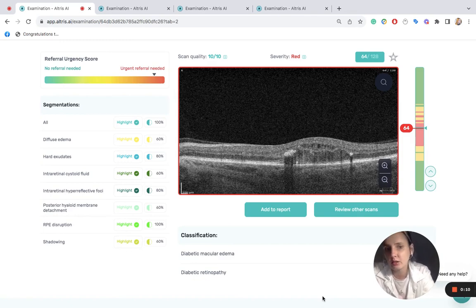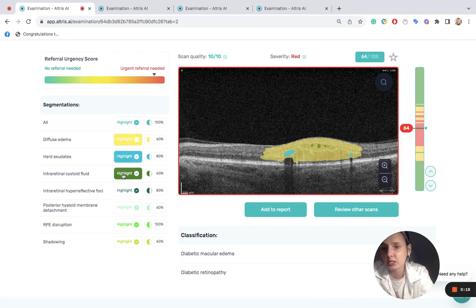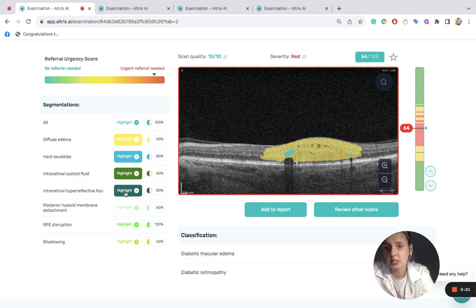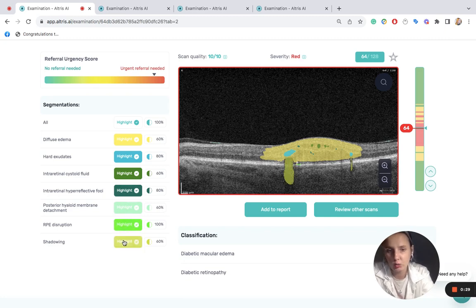We see the pathological signs that were detected on this scan: diffuse edema, hard exudates, intraretinal cystoid fluid, intraretinal hyperreflective foci, posterior hyloid membrane detachment, RPE disruption, and shadowing.